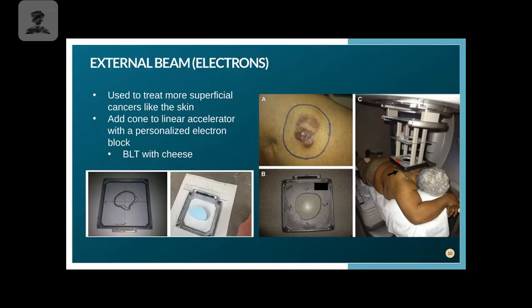Once you have that, we get to go create the true block. The first thing you do is take a piece of paper and draw that same shape that you already had on the glass onto the paper. Then you poke some holes in the paper with a piece of styrofoam underneath it. This blue chunk right here is a piece of styrofoam. I took the end of a pen, or whatever you want to use that's a little pokey, and traced the outside of the paper that was this same size. Then, once I have my outline, I take the paper off. You're going to use a styrofoam cutter.